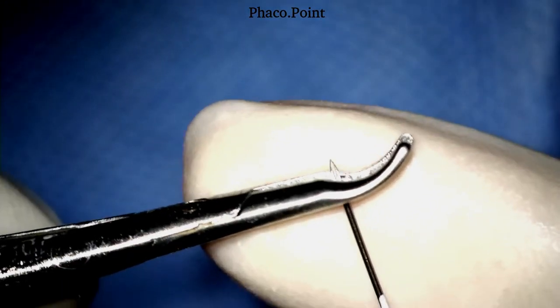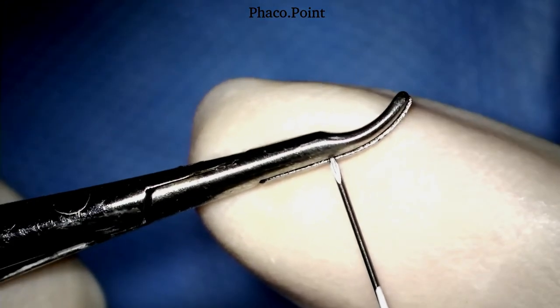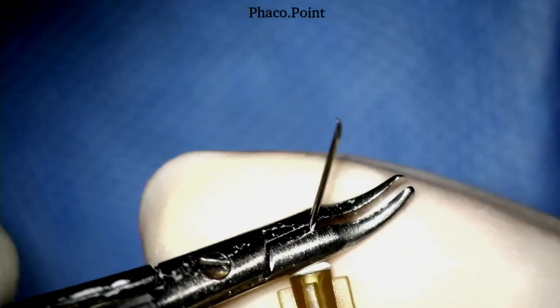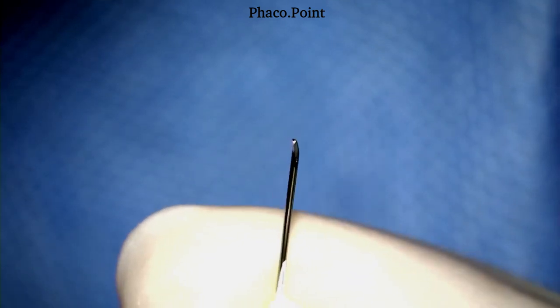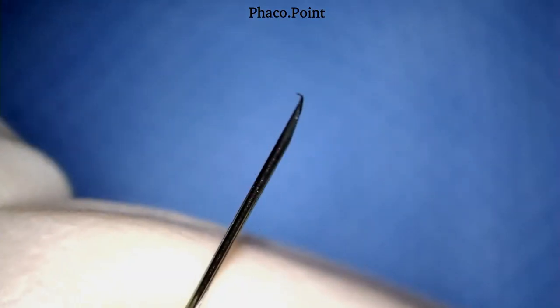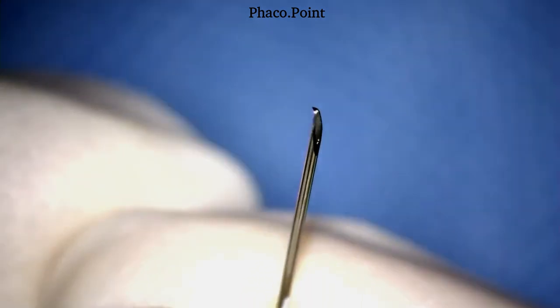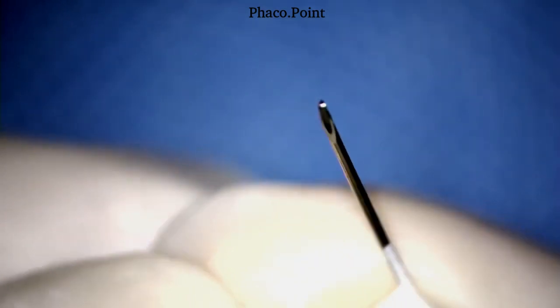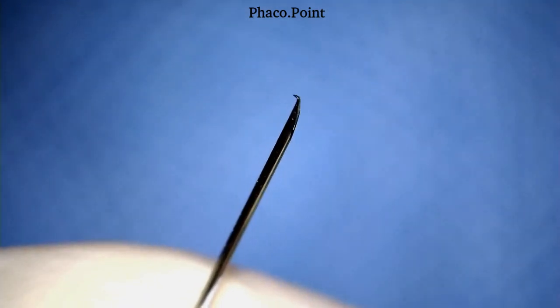In this part of the video I'm going to demonstrate the creating of a cystitome wherein the bend on the bevel is really tiny — like one-fifth or one-sixth of the entire bevel. This tip becomes a tip that is far too small. With a tip this tiny it is often difficult to engage the flap and to maintain that hold while proceeding with the capsulorexis.